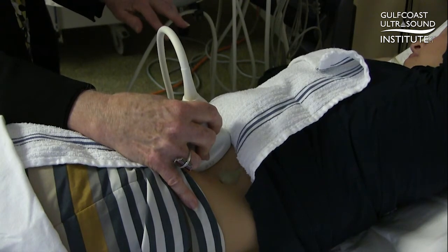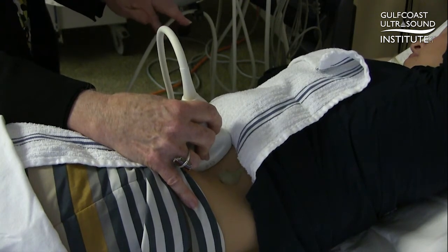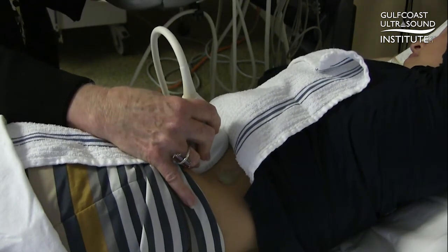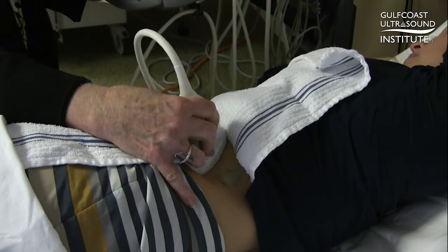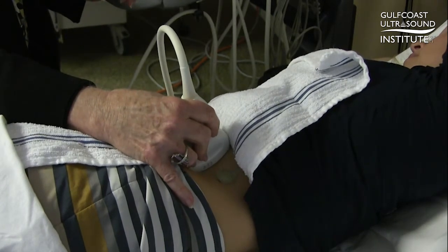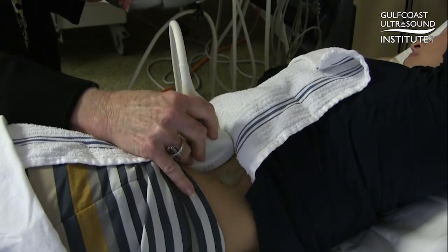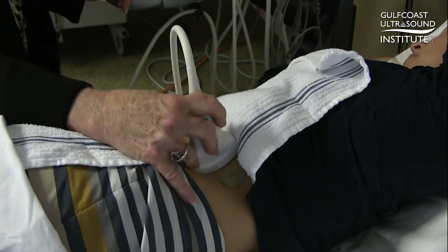Today's hot tip is on how to identify the left renal artery with the patient in a decubitus position. I have our patient model lying with her left side up towards me. I know that is referred to different ways by different folks, so I'll simply describe her positioning that way for now.